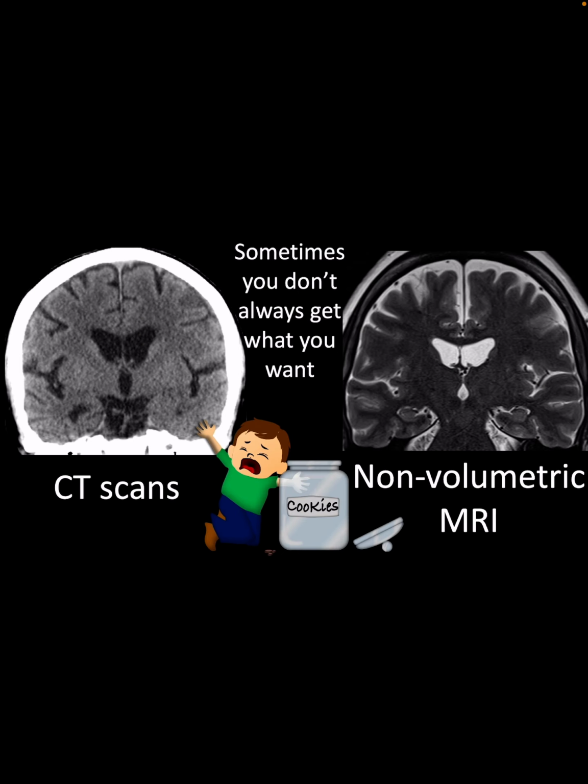Another problem is that the automated software analysis can only be used on studies that have specific volumetric imaging. But a lot of times that's not what you have. You have CTs or just routine MRIs, and you really want to be able to give the clinician an idea of whether there may be Alzheimer's present. And here, you're kind of out of luck. Automated analysis can't help you.